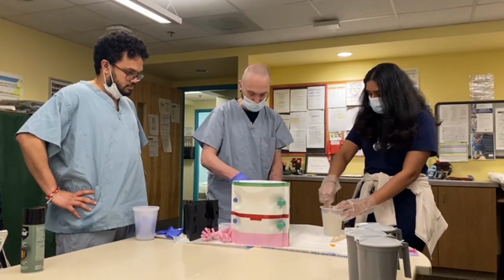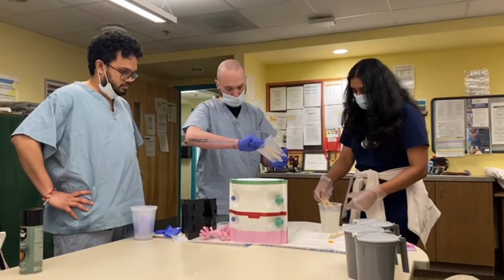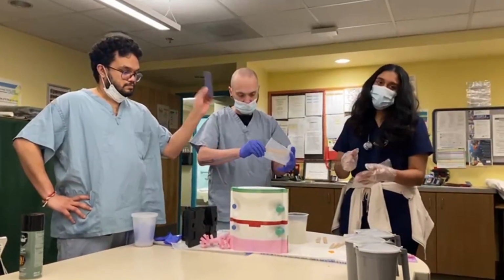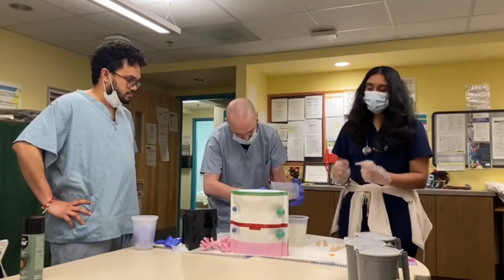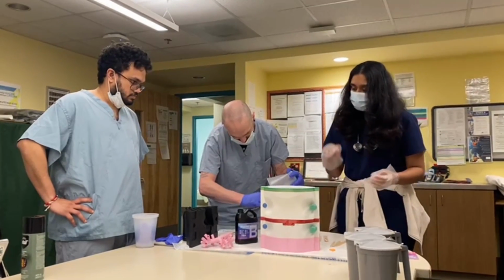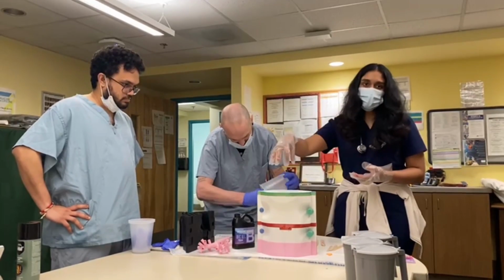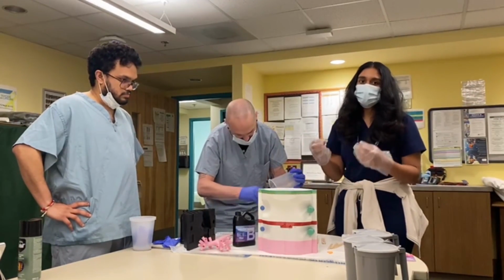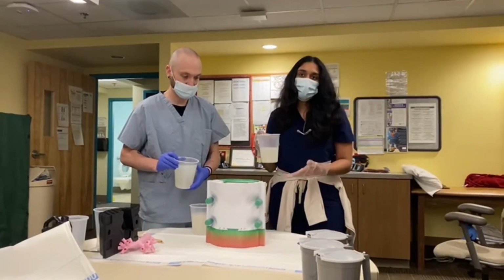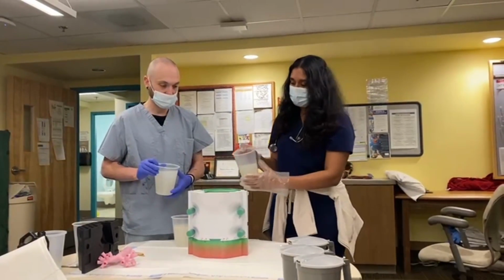Along with the rest of the 3D printed model, we also printed a few releasers into the side of the model. That is over here. They will help with getting the silicone out of the mold. As we talked about earlier, we used a releasing spray, which you spray on the inside of the mold, and that helps the silicone just slide right off. Okay, so now that we've got that all mixed together, we've got the silicone in batches and we're going to pour it into the mold.